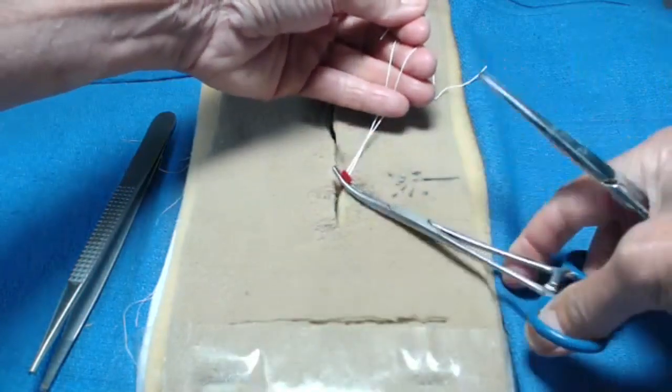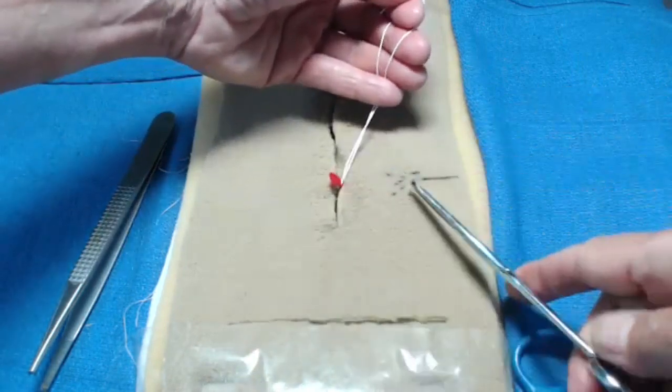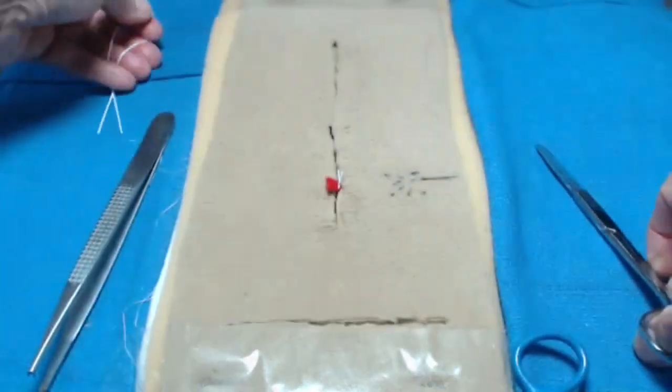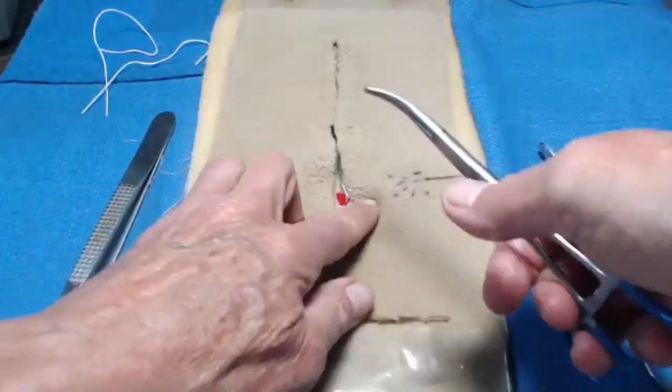I've tied a suture around the vessel. I can release the clamp, verify that no more bleeding is occurring, and then cut — and that's what a free tie is. It's not a complicated procedure. The hardest part is finding the vessel.